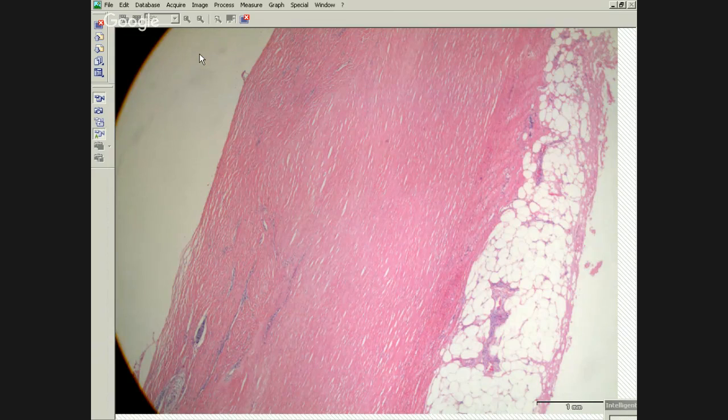So we've got, again, this is a pleural biopsy. 65-year-old guy with diffuse pleural thickening. We've got the chest wall fat on one side, and then we've got this dense pink hyalinized stuff with kind of a basket weave morphology, not very cellular. So what do we think of this?